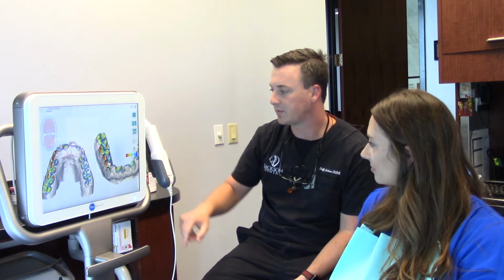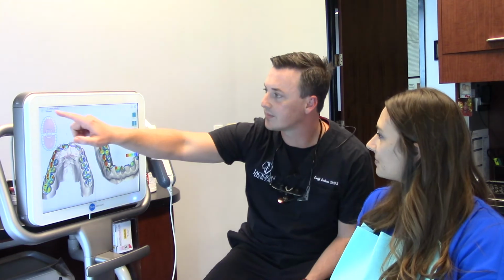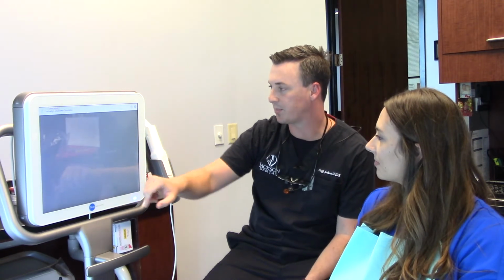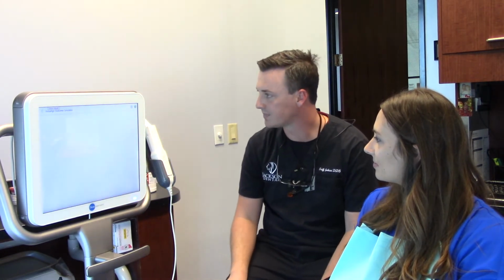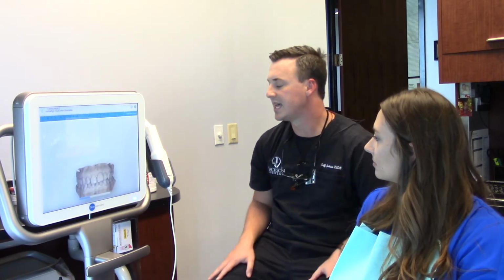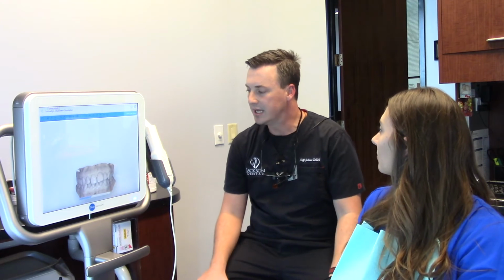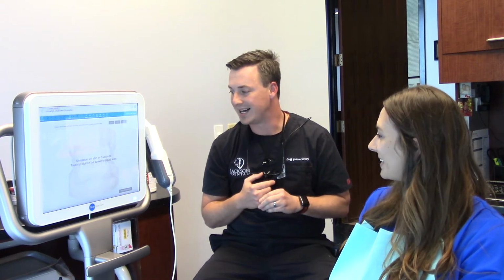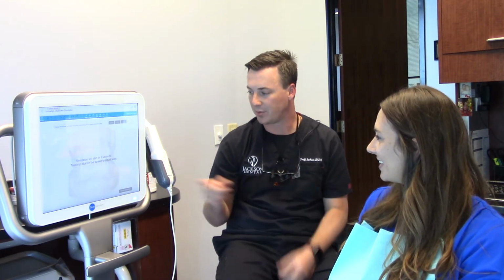Let me show you a simulation of what your teeth could look like if we put them in the right position and take them out of trauma. It's a pretty cool feature of the iTero, actually. Let's take a peek. It takes a couple seconds to load up, and while it does, the main reason we're having this conversation is because we're concerned about the longevity of your teeth, right? Mm-hmm. While teeth that fit together properly last longer and need less dentistry, they also look really nice too. It's always nice to have a beautiful smile. We'll see in a second what it will actually look like.